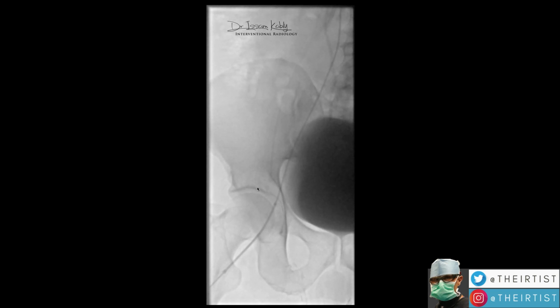So I am here in the spermatic vein with my microcatheter at this level, right above the femoral head, so right about the hip joint. You can see that the vein was successfully blocked by the surgeon. You can even see some staples here. This is the area where the surgeon has put some ligation and some staples.